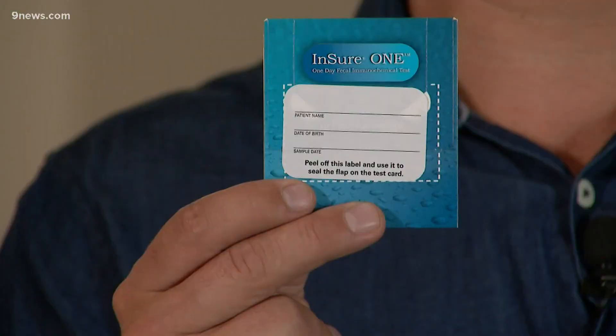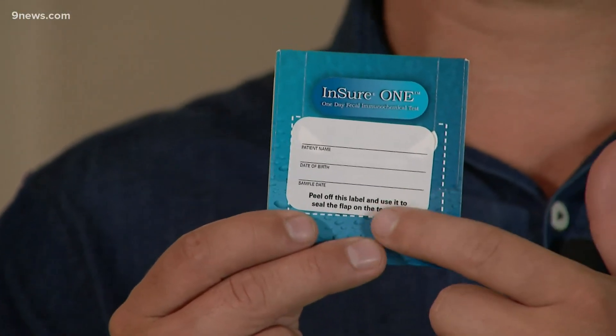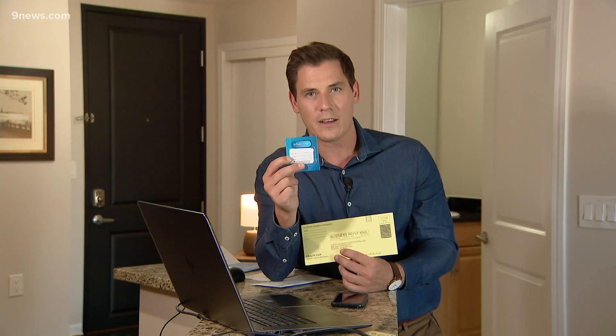So what you do is you take this sample card, you fill out your name, date of birth, and the date that it was recorded. Then you put this sample into an envelope, mail it away, and the lab's going to look at it for a variety of different things. It uses antibodies to look for hemoglobin or components of blood in the stool.